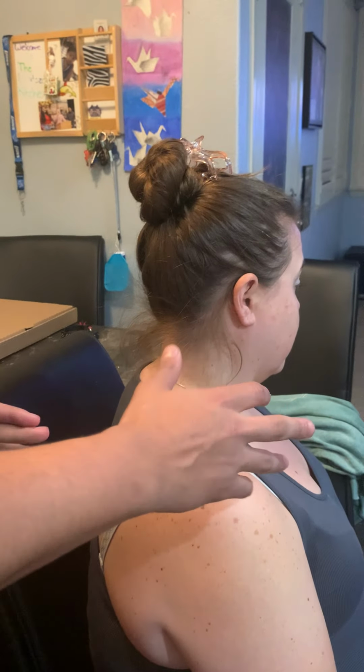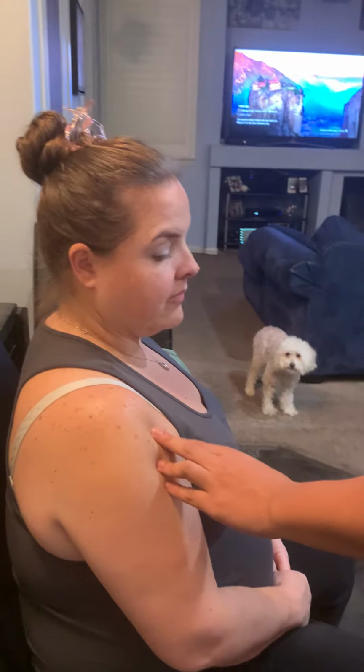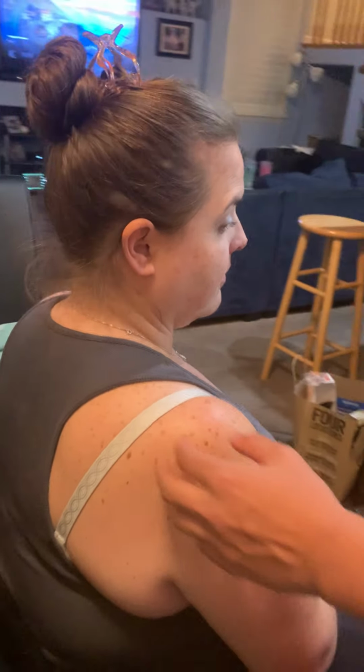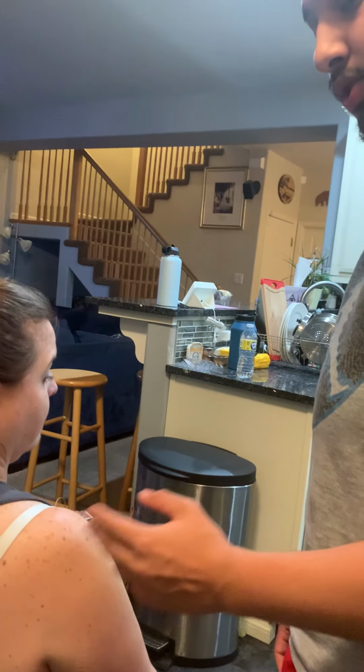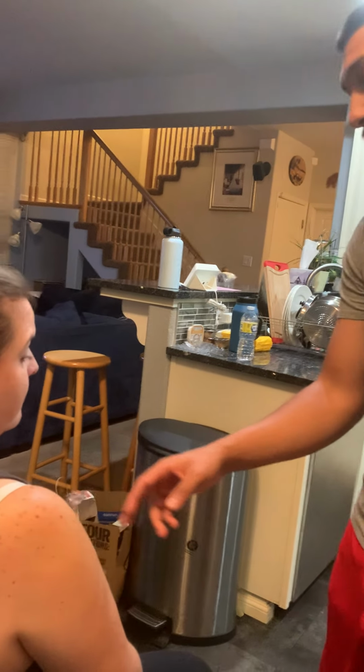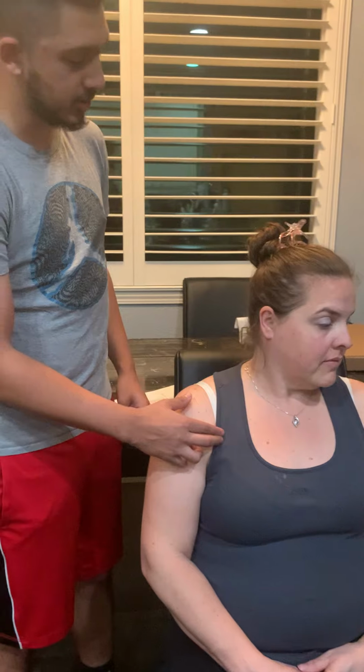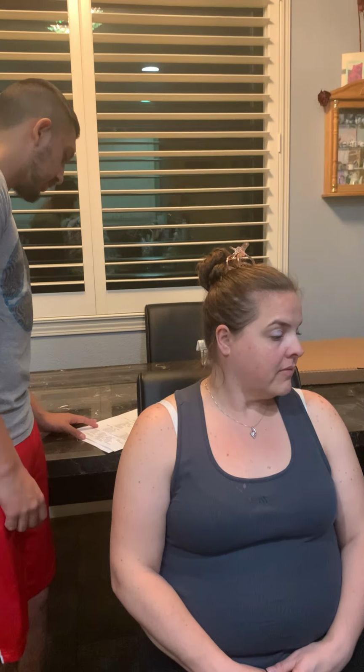And then we can go for the deltoid, which we can go right here, deltoid anterior, deltoid middle, and deltoid posterior. Then we would check for the pectoralis major, which, go ahead, come to the front, is right here. And then the pectoralis minor, just a little bit below the pectoralis major.